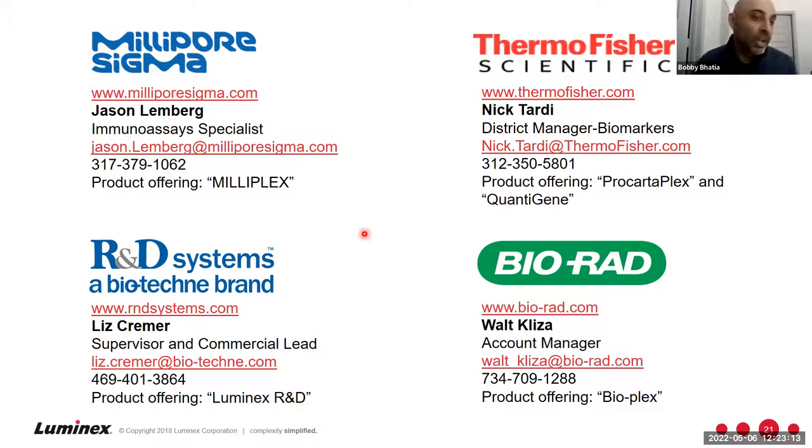So if you have a wish list of targets, don't hesitate to talk to that representative and say, I have a wish list. What can you do for me and put into a plate? Now, if they say to you, well, you can't put everything on a plate, they have to be split into multiple different plates, the reason why is that every company has panels, and at the end of my presentation, I'll show an example. In those panels, they have a list of targets that can go under a specific plate. That's because of what they validated and optimized based on sample dilution requirements, sample detection ranges, and what minimizes cross-reactivity issues and so forth. Their job is to make your life easier, not harder.